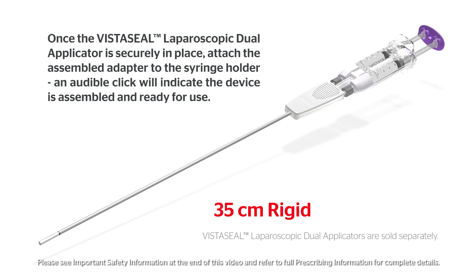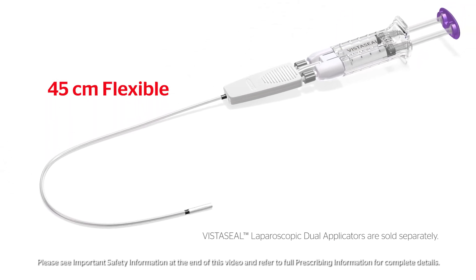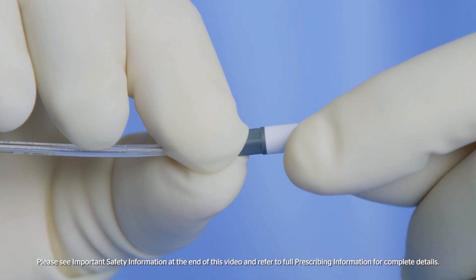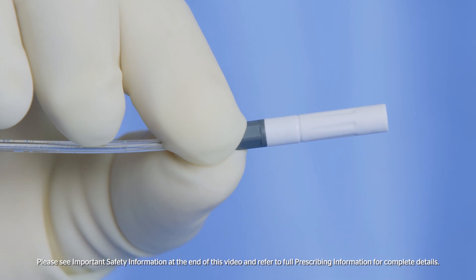An audible click will indicate the device is assembled. The device is now ready to use. Ensure the airless spray tip is securely tightened. The red indicator will not be visible if the airless spray tip is securely tightened.